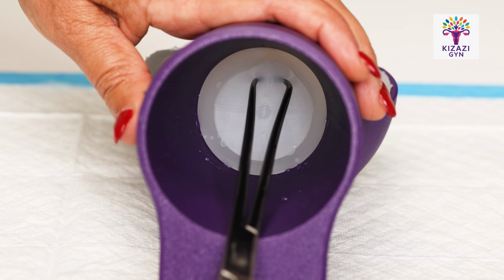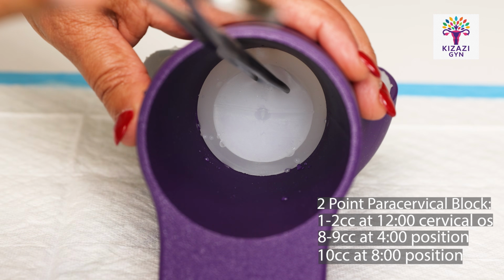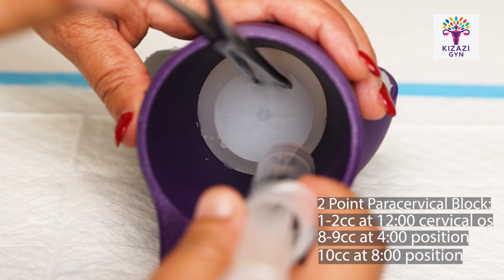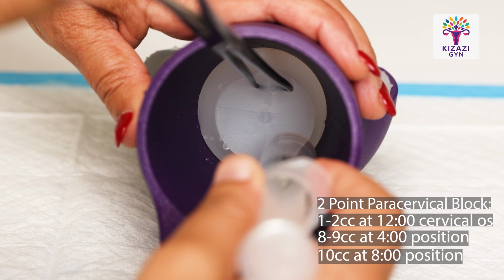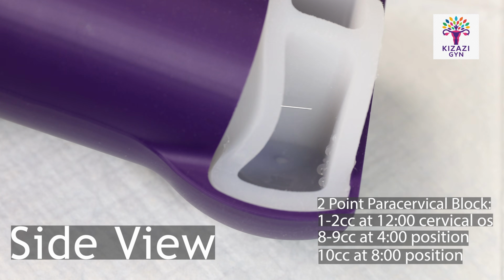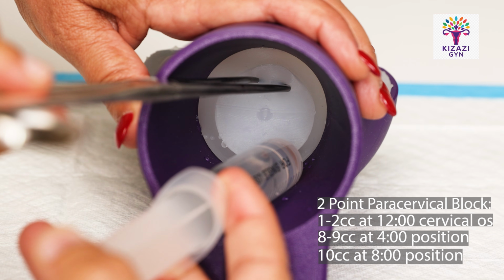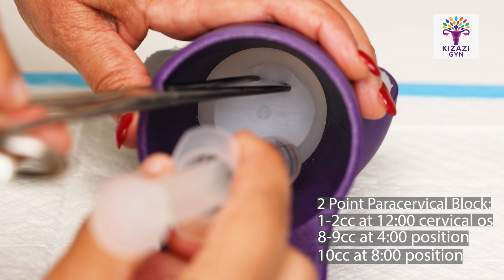Now let's practice our 2-point paracervical block. Since you have placed the tenaculum already, you're going to go ahead and inject into the 4 o'clock location just outside of the cervix here. You're going to insert the needle about 1 to 3 centimeters. Once you get there, you're going to aspirate to ensure that you're not in any vessels, and then you're going to go ahead and inject. Then you're going to come out.